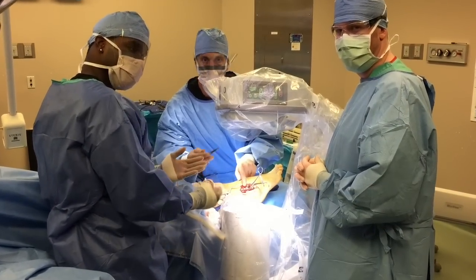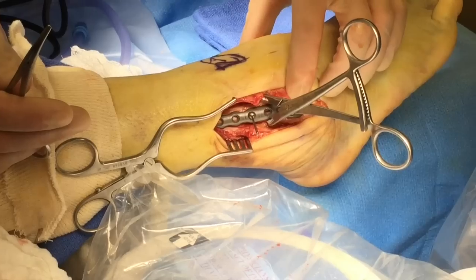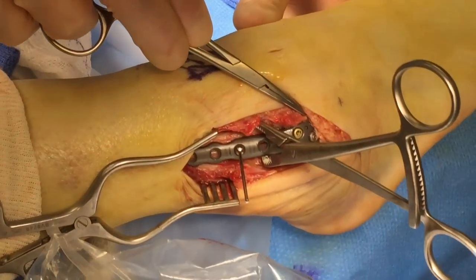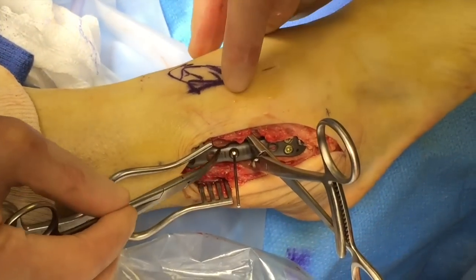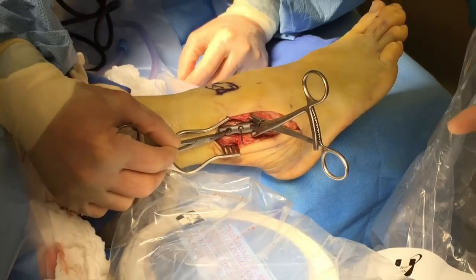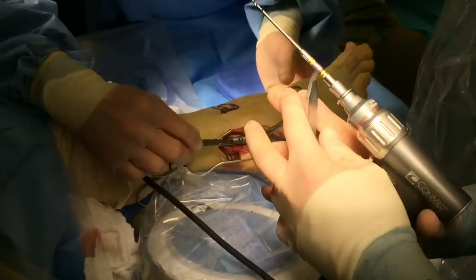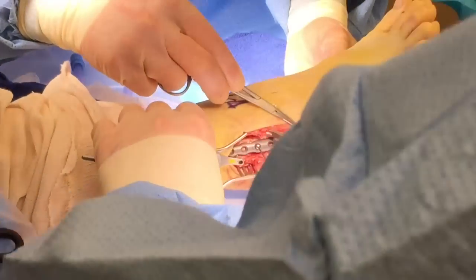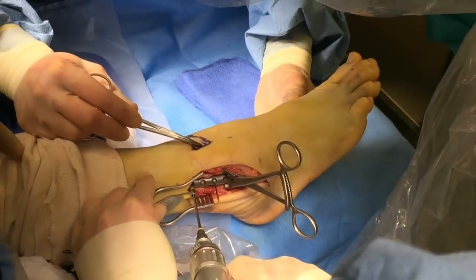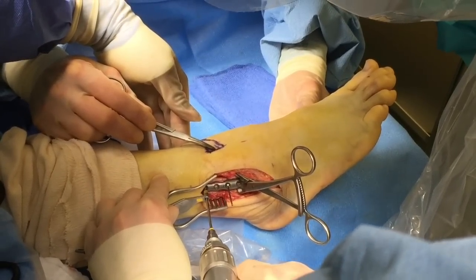We have the distal area fixated. Come a little closer and see what we've got here. The three screws distally — two are non-locking and one is locking distally — where we have the area of the distal fibula fixated. The fracture line is right about here and now we're going to throw some screws in the proximal area. First we're going to show the drilling — the first ones we did were one cortex because we're at the level of the joint. This one we're going to drill all the way through.